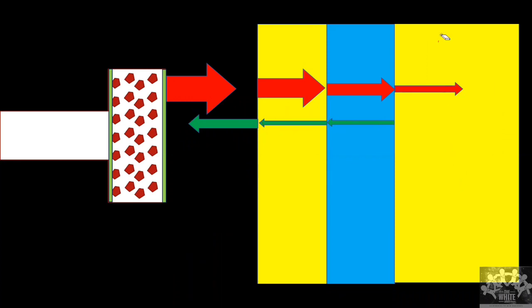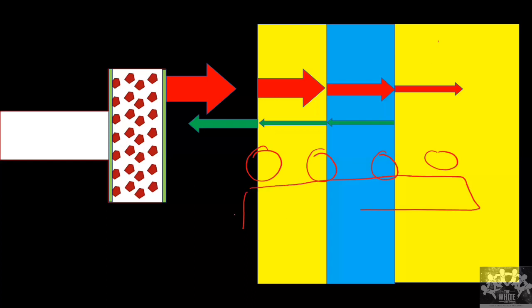According to this physiology of reflection, we would expect these structures to be brighter and these structures to be less bright. But what we usually do is put in a correction, because we know that as we go deeper and deeper, the sound energy is reducing.